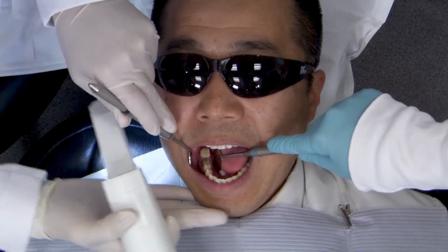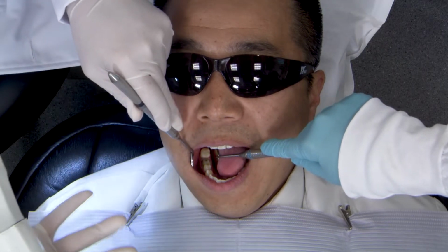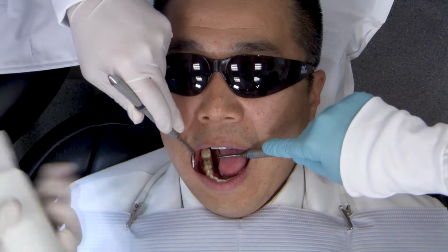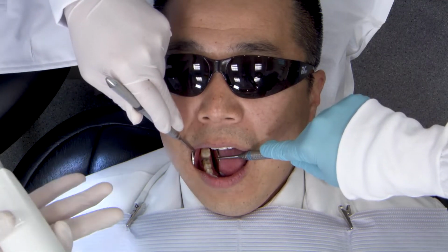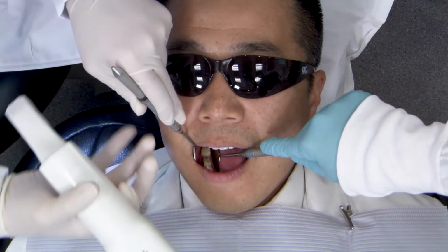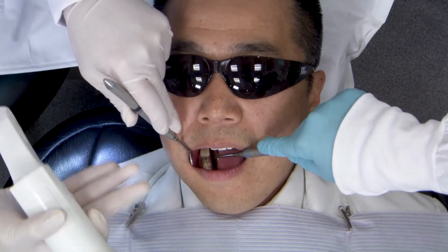Also having the patient relax a little bit, on the lower or upper, especially when you're very far distal, making sure the patient's relaxed and sometimes not at that full opening. You can ask them to close slightly to release some of the tension. If they're really forceful during their opening, it just tightens up all of the soft tissue and makes it harder to retract those areas.